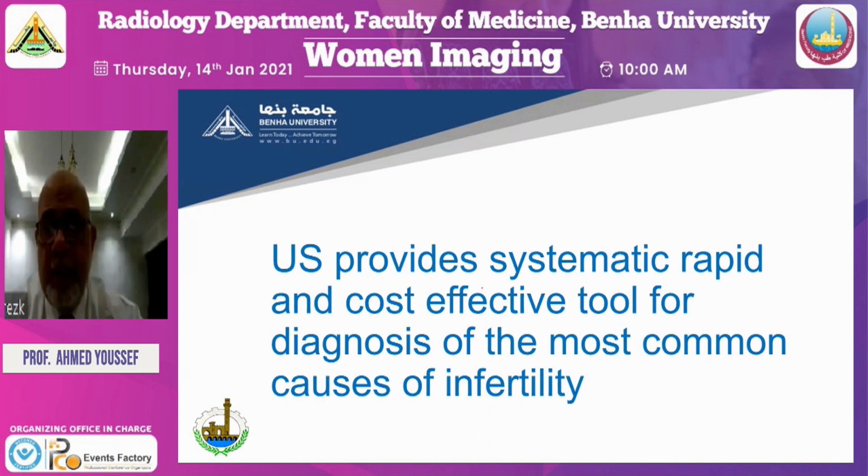Ultrasound provides a systematic, rapid, and cost-effective tool for diagnosis of the most common causes of infertility, and it is also used as a therapeutic machine, helping me in the IVF for egg collection, for embryo transfer, and also for aspiration of ovarian cysts.